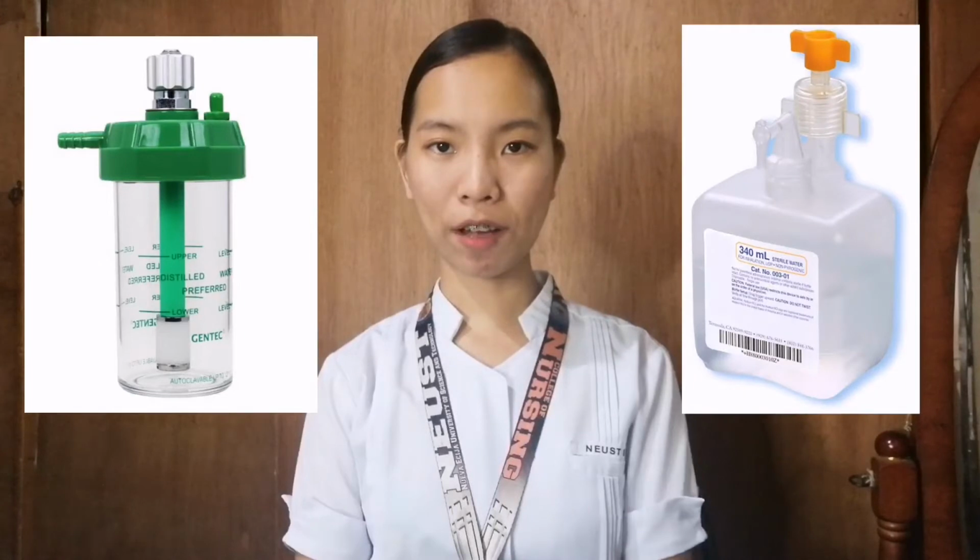For the equipment, we need to check for the oxygen delivery device as ordered by the healthcare provider. Next is oxygen tubing, so we need to consider the extension tubing. Humidifier if indicated, sterile water for humidifier, oxygen source, oxygen flow meter, and appropriate room signs.